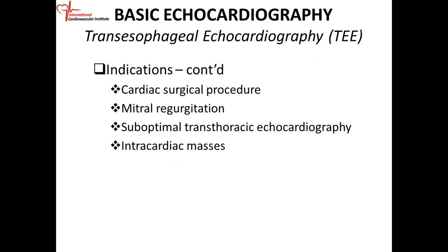Even some surgeons doing regular coronary artery bypass surgery will also do it under transesophageal echo guidance. So in cardiac surgery, the TEE is a very important part of the procedure.